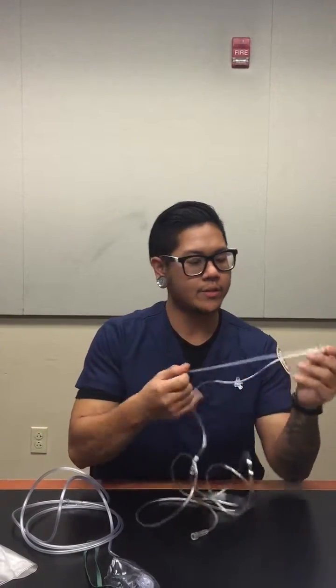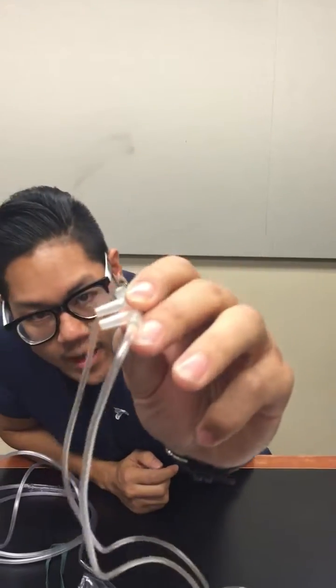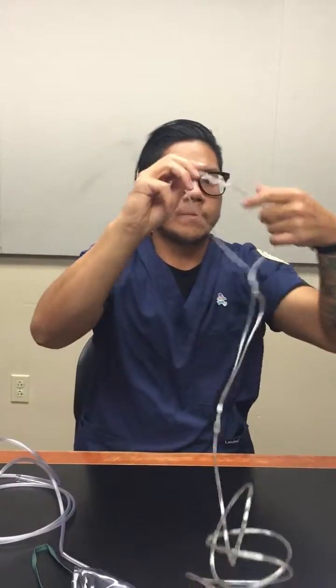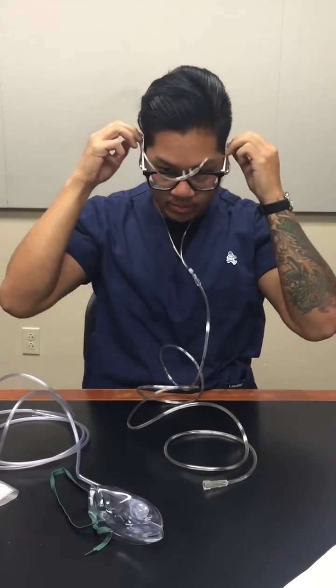First I'm going to show you how to put it on, and then I'm going to run through the FiO2 calculation for it. You're going to have these two prongs, and they need to bend a little bit downwards. You can put it around your ears, and then it's going to go in like that. Then you can tighten it up a little bit from down here, and loosen it too if you need to.